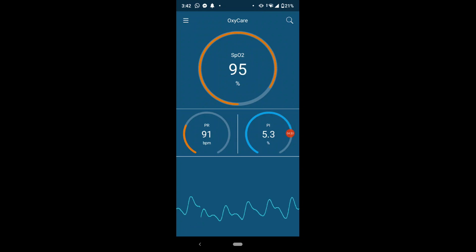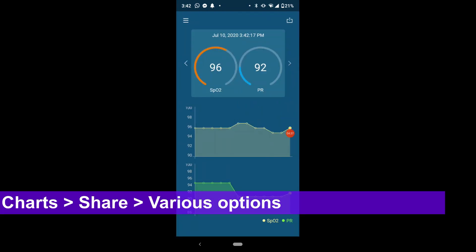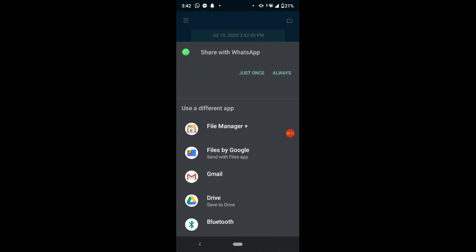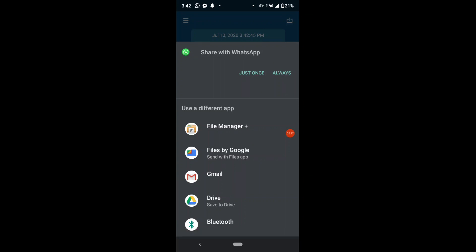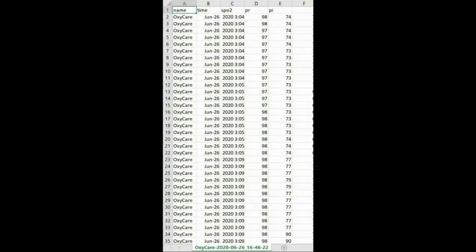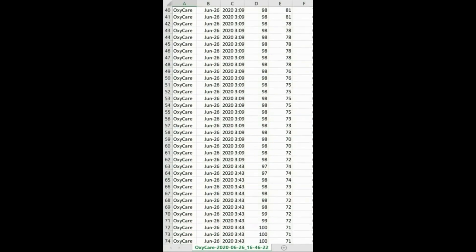Once you click on the chart option on the menu on the left side, it takes you to a single screen with three broad charts. In the right-hand side top corner, you will see the share option. You will be able to share the log on any of the mediums shown on the screen. I've used WhatsApp during my review. Using the desktop version of WhatsApp, you can download the file — it's an Excel file — and open it in Microsoft Excel to view your log on a computer screen.